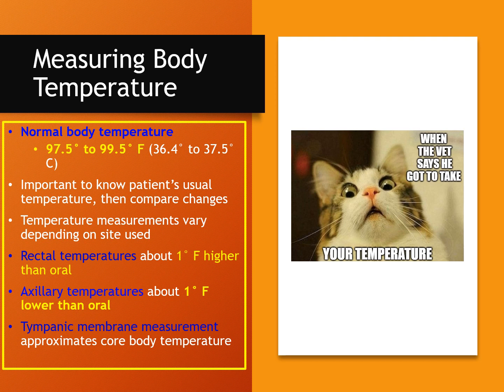The tympanic membrane measurement, that's when the thermometer goes in the ear, is pretty good for determining core body temperature.